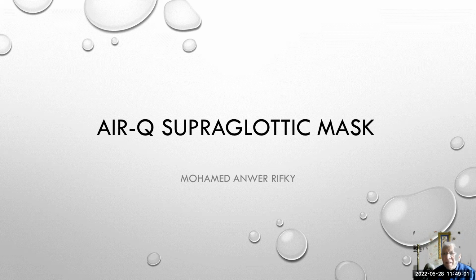We discussed a thesis a couple of days ago about using the AirQ supraglottic mask to aid intubation in patients. 26 of the patients were subjected to blind intubation without the aid of the fiber optic. On the other side, the other 26 patients were intubated aided by the fiber optic device.